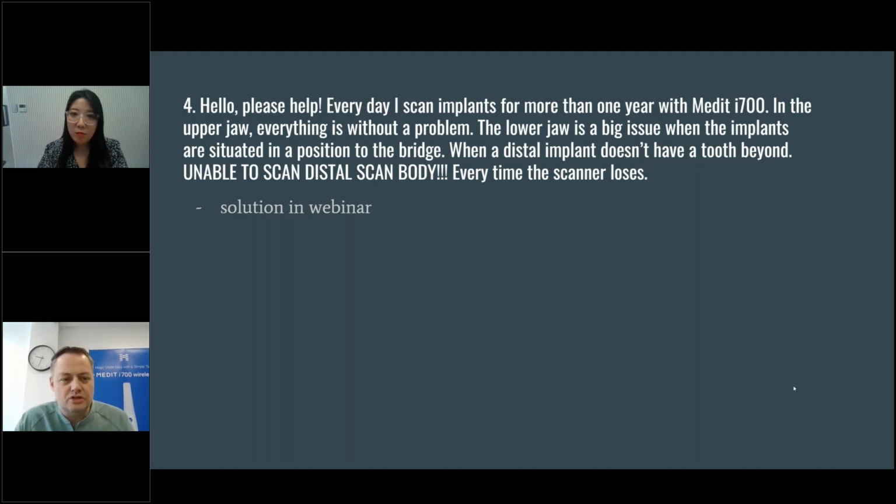So you're going to extrude it from the syringe, place markers on the edentulous span, and the assistant is going to come with the curing light, exactly after you, and she's going to cure these patterns in the following seconds. So you place them, and in 1 second they are already cured.